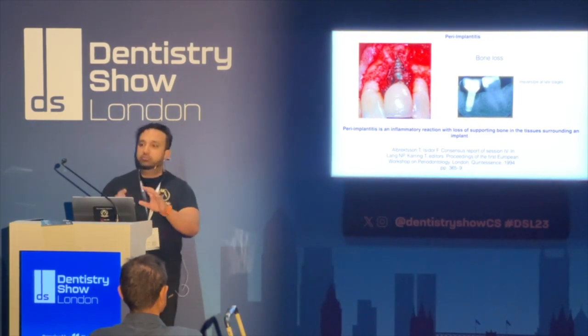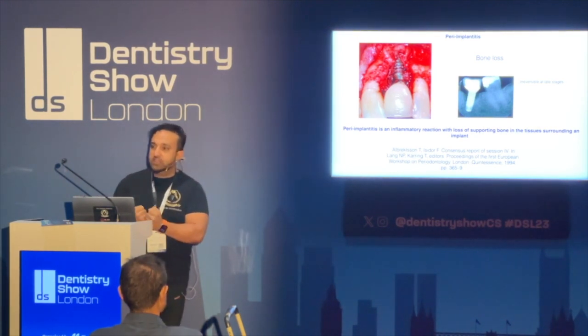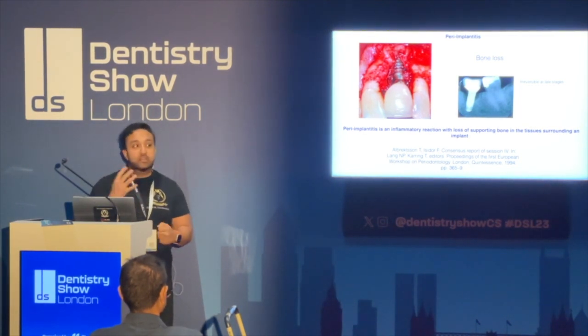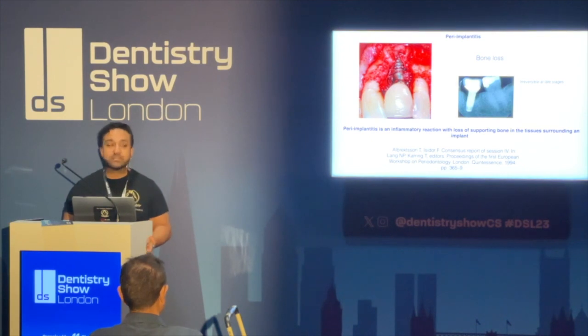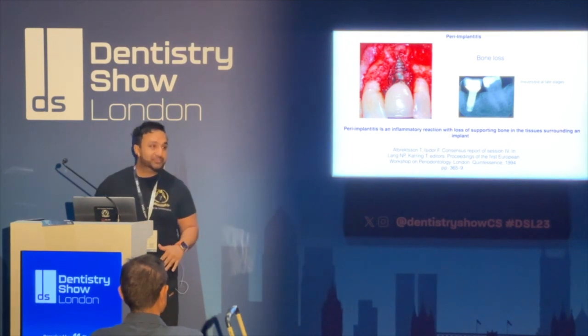You have to physically remove the granulation tissue around the implant itself, and you have to work out how much of it's osseointegrated. It might be solid. You then have to clean the threads, smooth the threads with a procedure known as an implantoplasty, which is an accepted procedure, where we smooth the threads out so you don't have any plaque retentive factors, and then you put everything back.